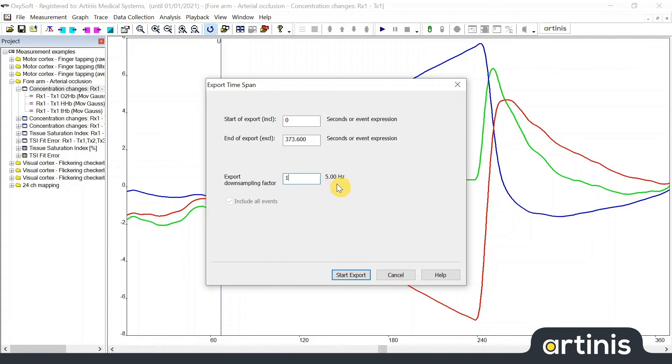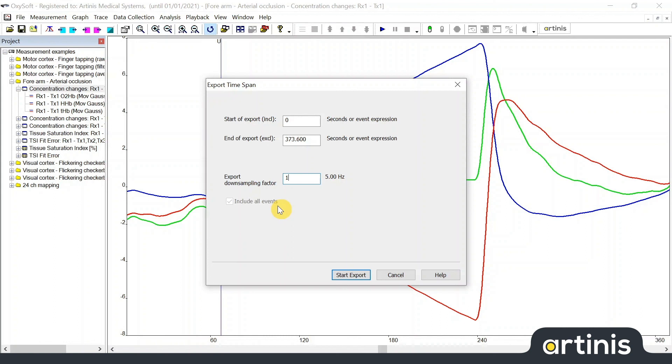If the include all events button is selected, all events in the measurement will be exported. If it is not selected, only those events created during the measurement will be exported. This means that events made by generate events or insert events are only exported when the box is selected. Click start export to start your export.